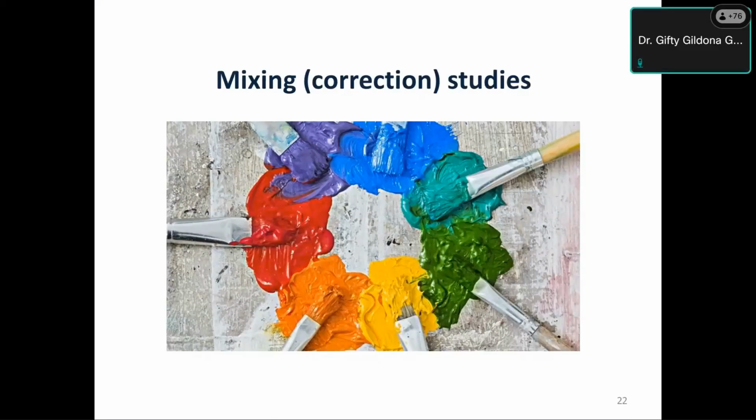It is actually a mixture of 1:1 ratio of the patient's plasma along with the normal plasma, sir. We want to see, after a PT and aPTT is done, we need to classify exactly where the patient lies in the coagulation problem, whether it's an intrinsic or an extrinsic pathway, sir. If it does get corrected after mixing, then we can suggest that it is a coagulation factor issue, sir. If it is still prolonged after that, then we can suspect maybe some other inhibitor is causing the issue.